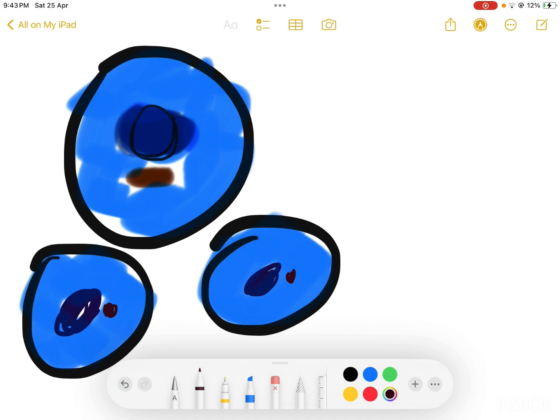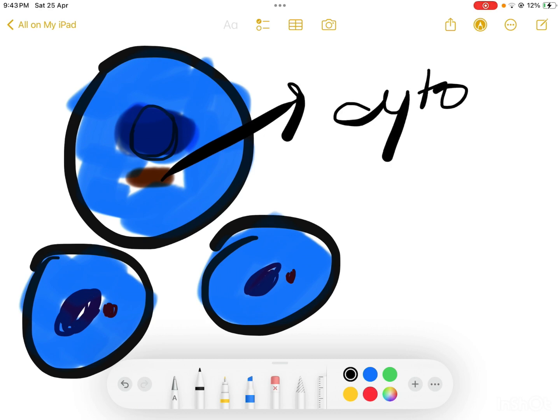So you should keep in mind that when this tumor is there, and if it is going to give you the markers dot like positivity, you have to look keenly for the marker. So what are the markers that can give you cytoplasmic dot like positivity?